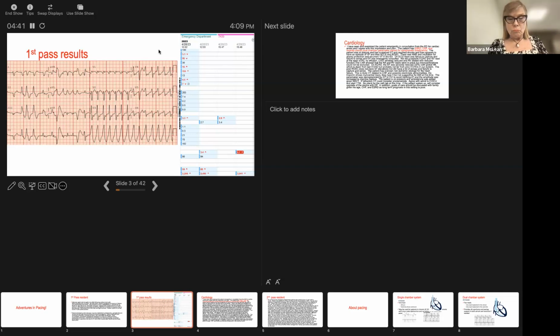But regardless, he's got pulses, so he gets, I assume, even though they wrote defib, I'm assuming that he was cardioverted, not defibrillated, because they wanted to get him out of this rhythm. They bolus him with amiodarone, et cetera, all great. But I want to also take a look over here.